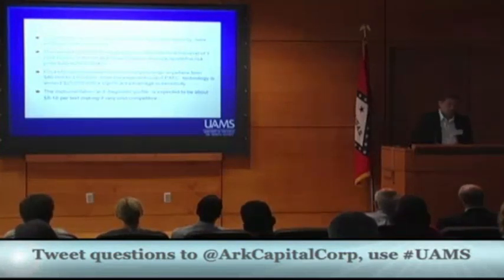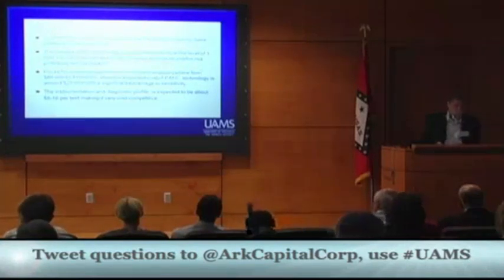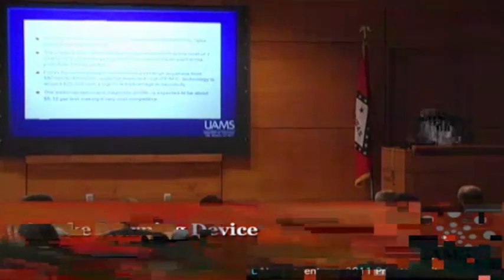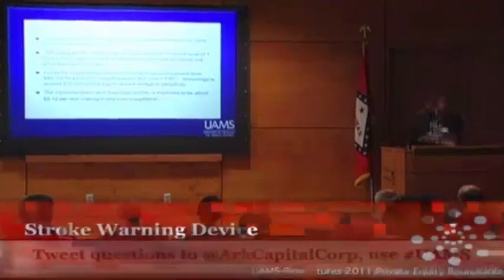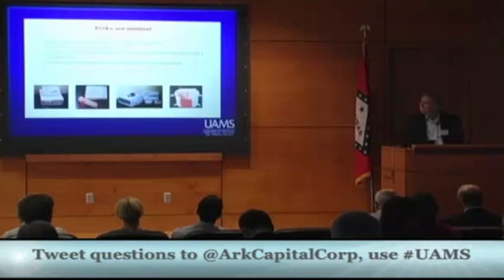Cost. An ultrasound device, stationary, is in the lower range: 50,000 for a small one or 150,000. Our prototype device currently costs 60,000, but we didn't plan to use it as a clinical device. It's just an experimental device. If you buy a diode laser, as we did, it's approximately $25,000 per device. But this is a universal system, so you can use it for different patients, and the cost for one analysis is a few dollars right now.